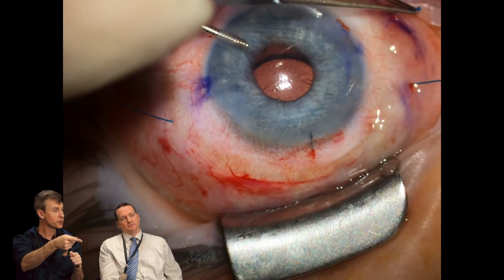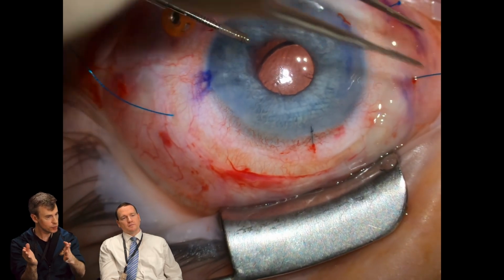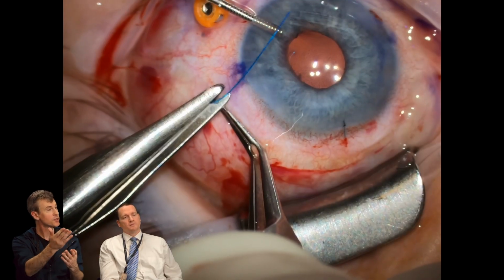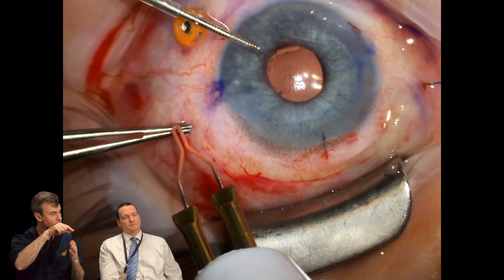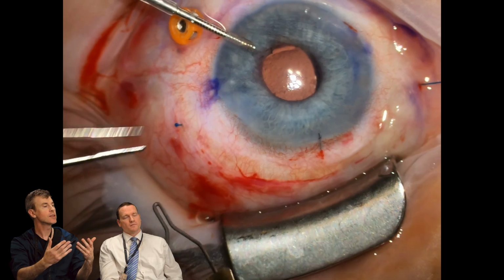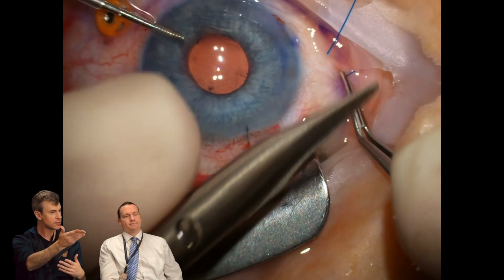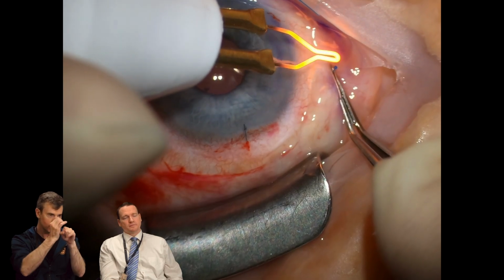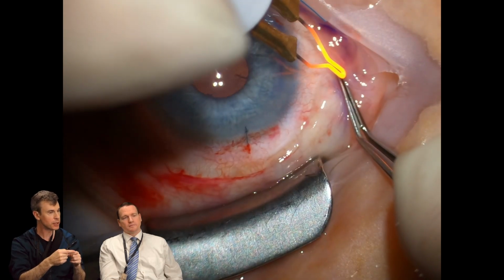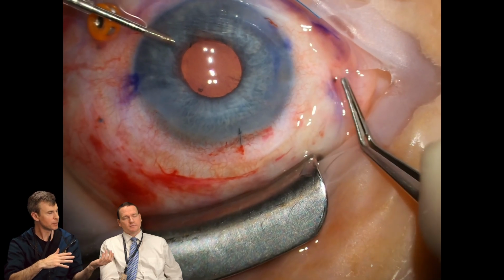But that makes any scleral fixation more difficult because usually you have to remove the conjunctiva, do your sutures, and put the conjunctiva back, which is difficult if it's scarred. This little knob slips underneath the conjunctiva and it heals over it. So it's more forgiving in these kinds of cases. And as you said, all I do is create this little bulb that prevents it from slipping in. The suture is thick enough. This is probably the equivalent of a haptic.